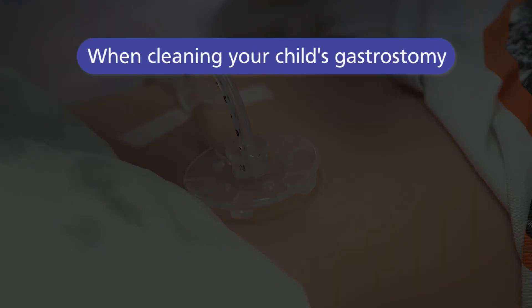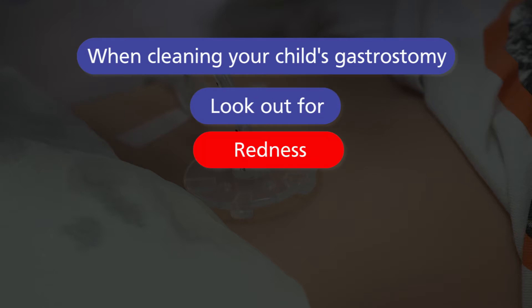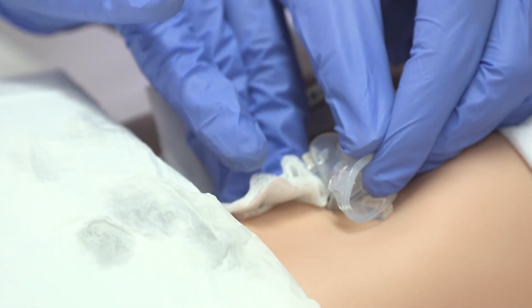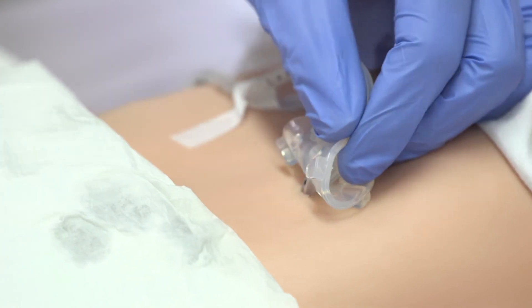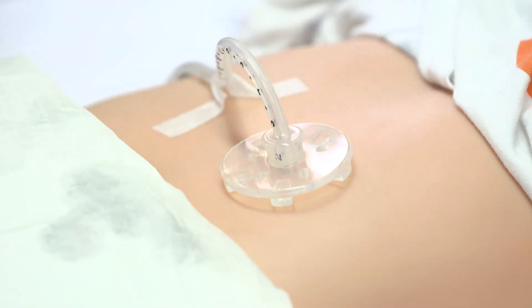Whilst cleaning your child's gastrostomy it is important to check the site for any redness, swelling or oozing, as these may be signs of an infection which you will need to report to your child's healthcare professional that supports you at home. Once clean, repeat the process with dry gauze. This is just as important as cleaning, and will help prevent the site from getting red and sore.